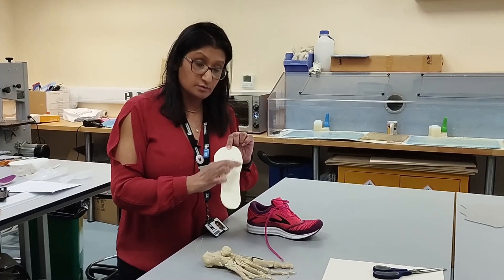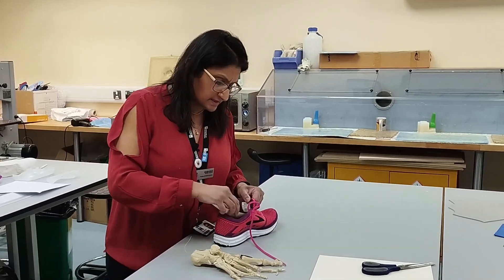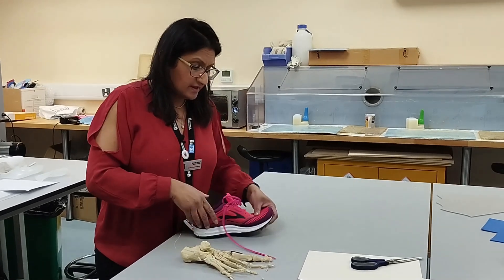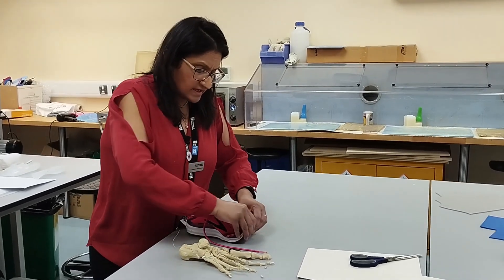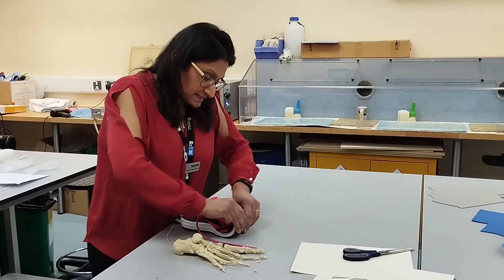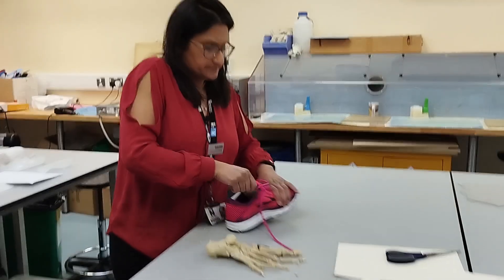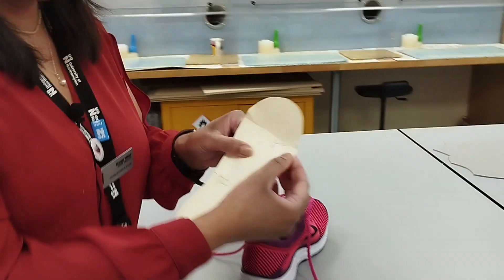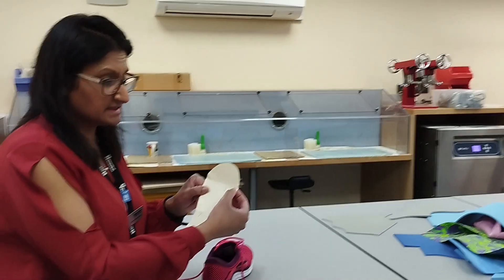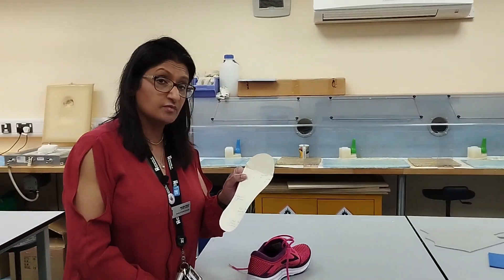If you're having trouble locating the 1st metatarsal head, another method is to place the inlay back into the trainer and flex the forefoot of the trainer. Where the crease sits will normally be just above the 1st met, so about a centimetre to a centimetre and a half below that crease is where your 1st met is located.